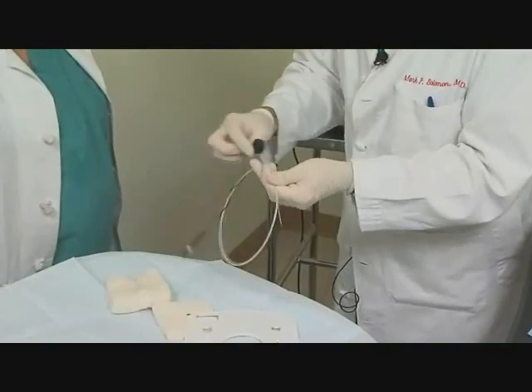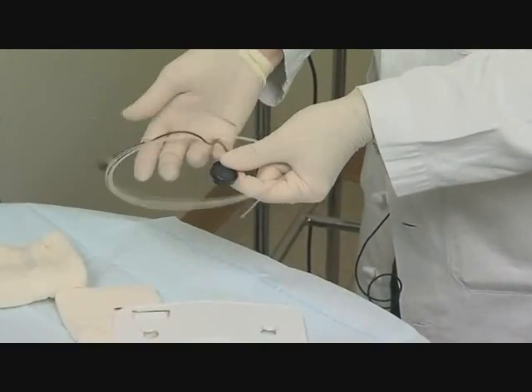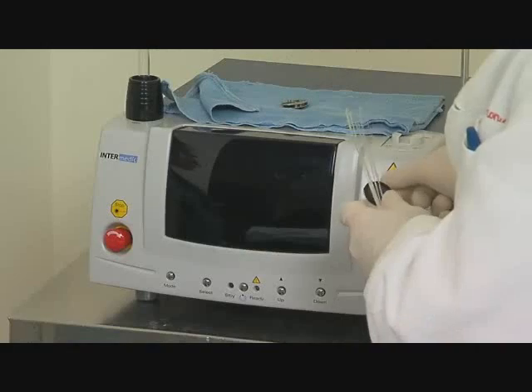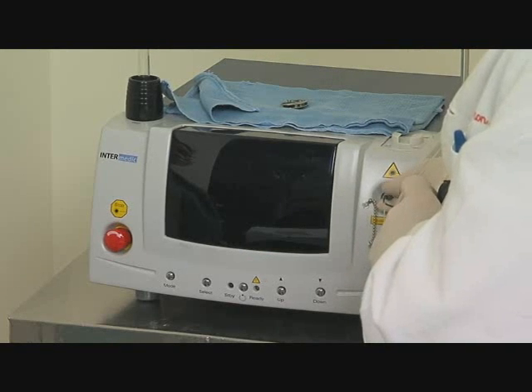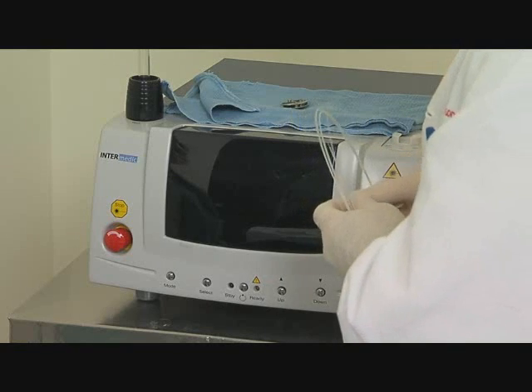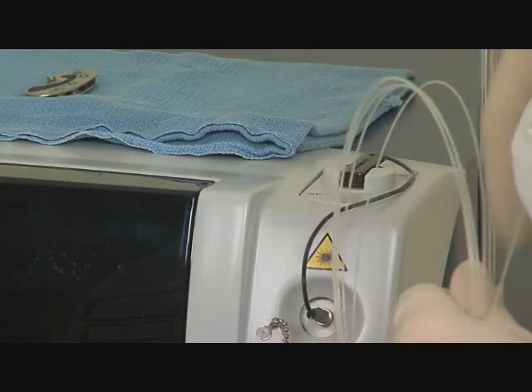The fiber is removed from its container. Fiber is placed into the laser aperture and secured by screwing it in. Once the fiber is snugly attached, the magnet with its chip is placed in the port on top of the laser, and the laser is turned on.